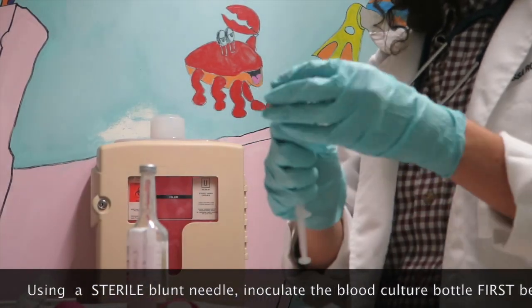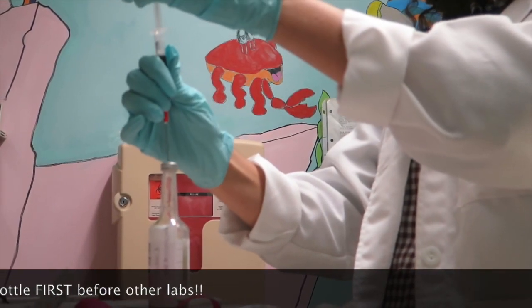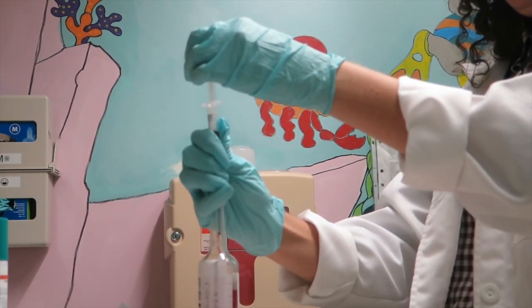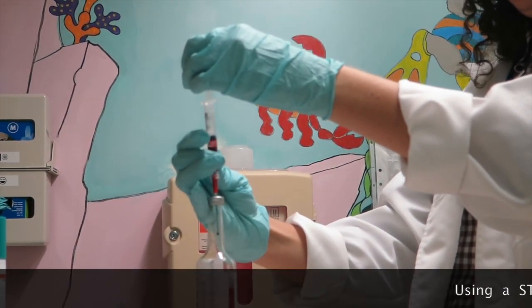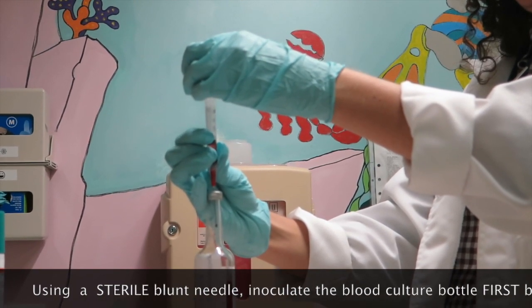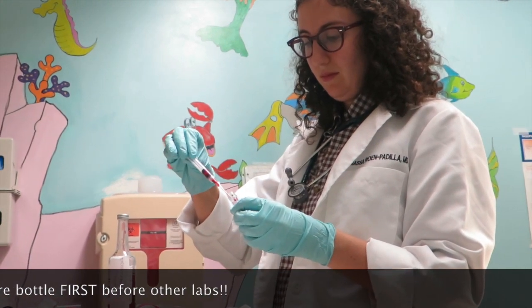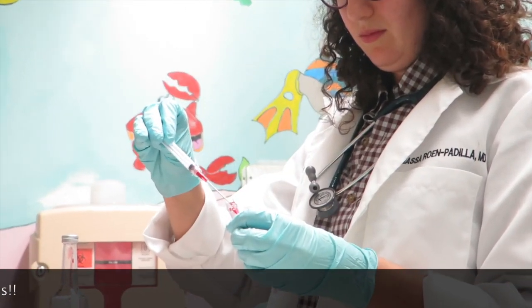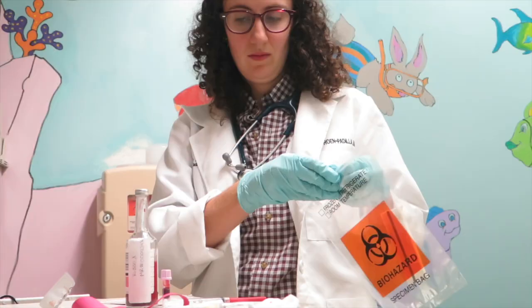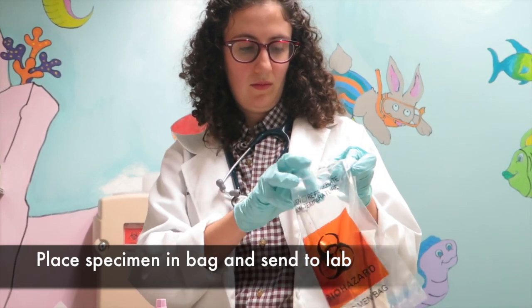Using a sterile, large-gauge blunt needle connected to a syringe, inoculate the specimen into the first blood culture bottle. Allow the appropriate volume of blood to enter the tube and hold the syringe plunger firmly to prevent suction of the entire sample. If blood is being collected from multiple labs, the blood culture bottle must be filled first to limit the chance of contamination. Place labeled bottles in a specimen bag and send to the lab.